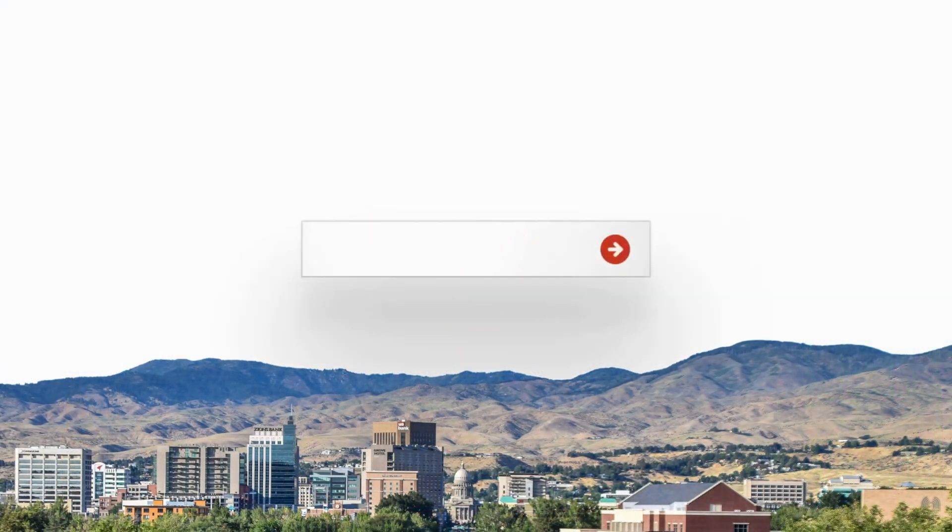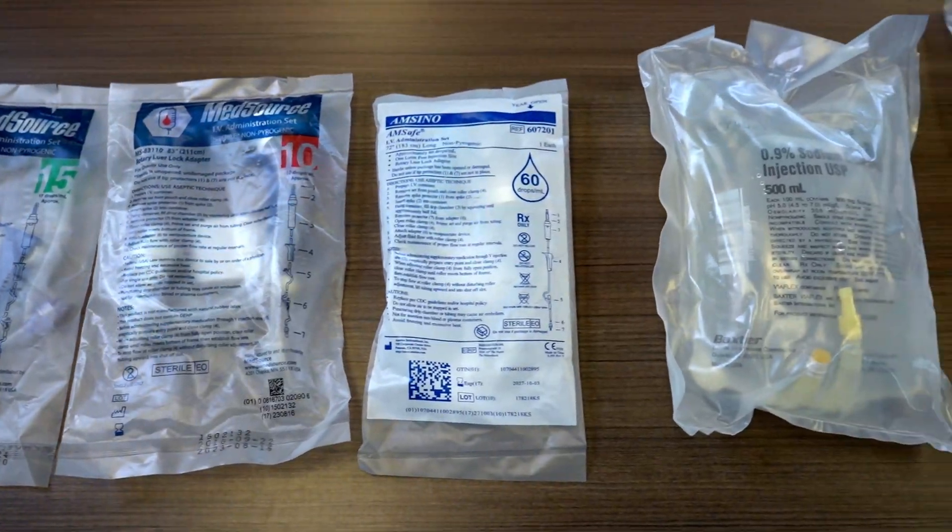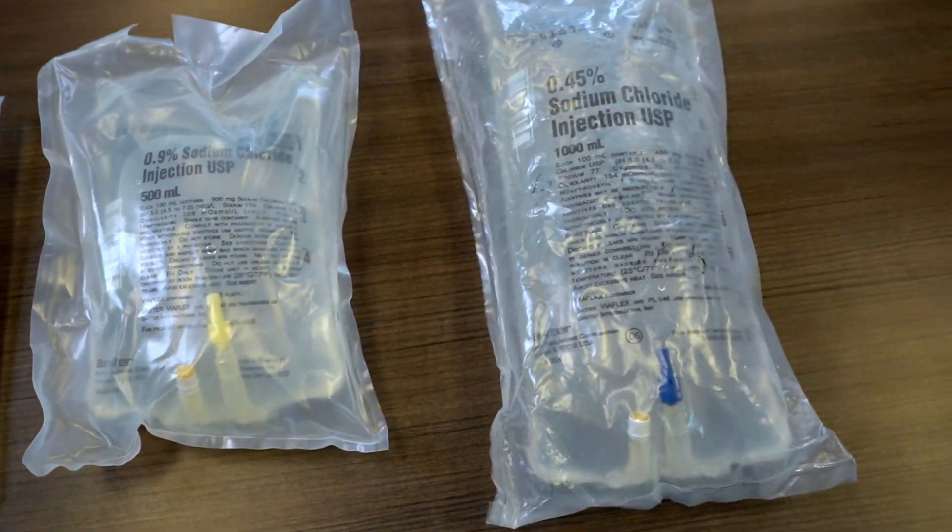Hi, I'm Sabrina with IMA, and today I'm going to show you how to spike an IV bag. There are many different IV solution and drip sets that you may need to set up, but generally they're all set up the same way. Today we're going to go step by step to show you how to spike an IV bag.